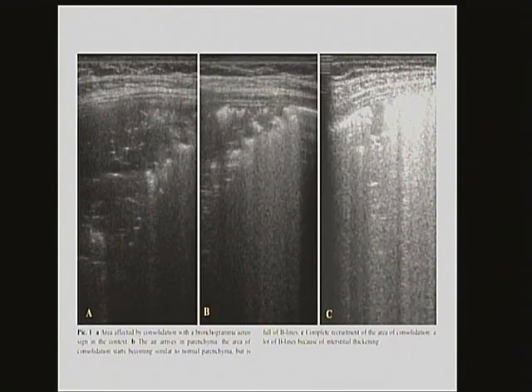And again, this is kind of showing it on a more zoomed in level. Here is your consolidation. Now you increase your PEEP, you go to sort of subpleural consolidation, but you're starting to see some better aeration here. And now you're back to B lines. And this is probably the way that you want to do it. You increase the PEEP a little bit and you look to see the changes on your lung ultrasound.